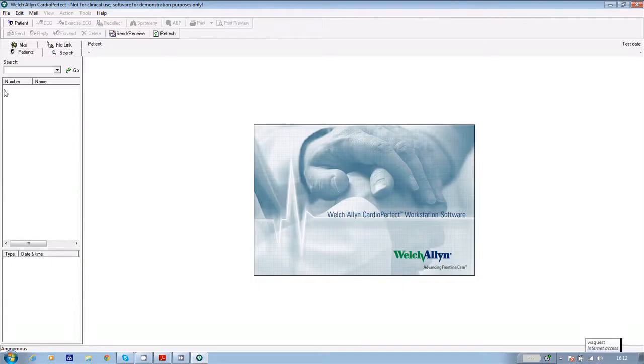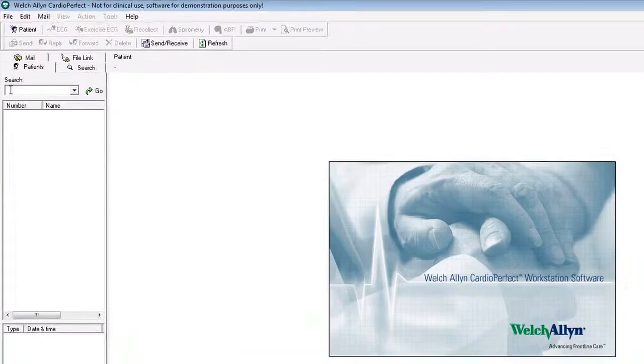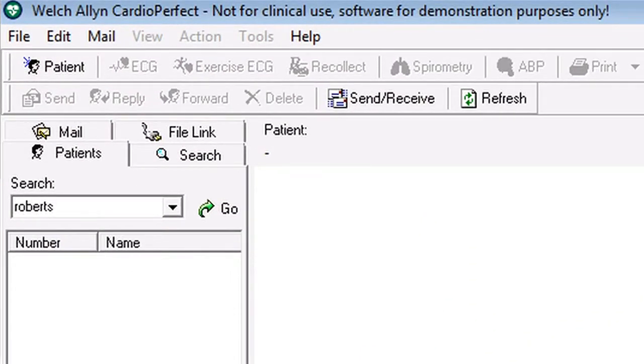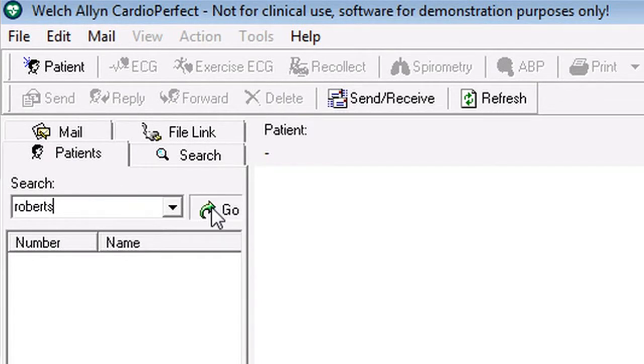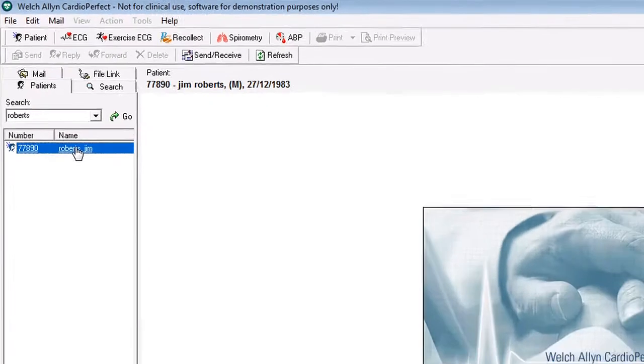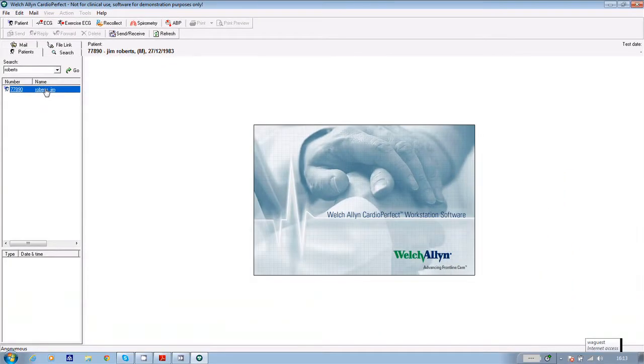Now if they have had a test before, open the software and using the search facility key in their surname or ID number. Click on go and the name appears underneath. Highlight the name and you're ready to start the test.